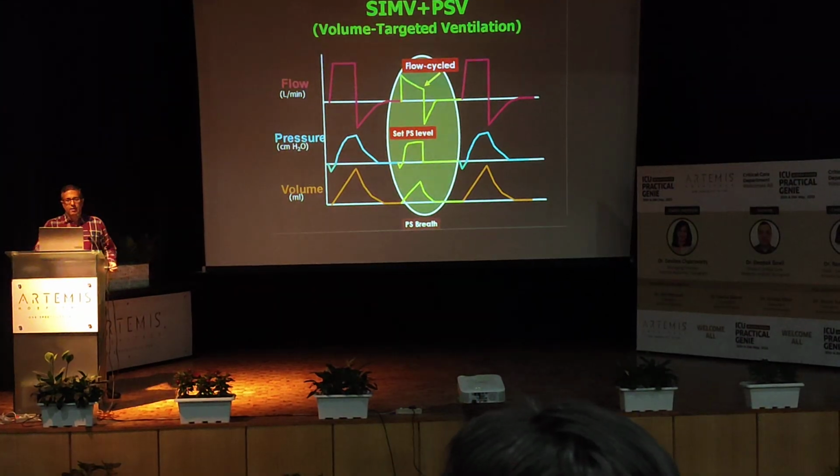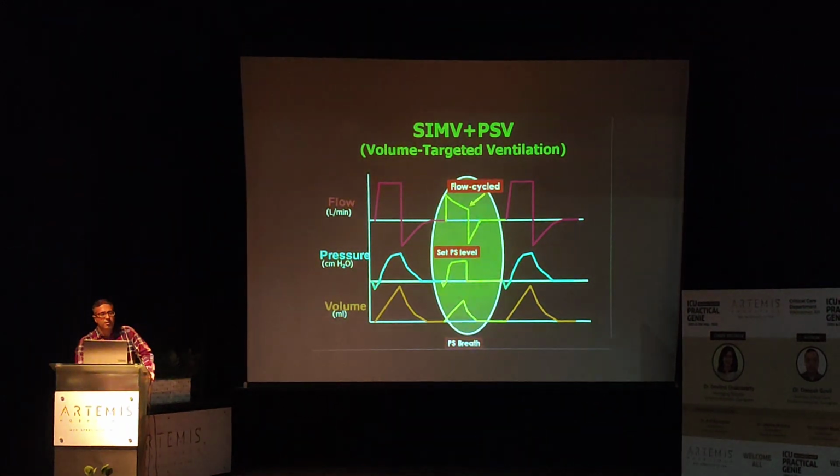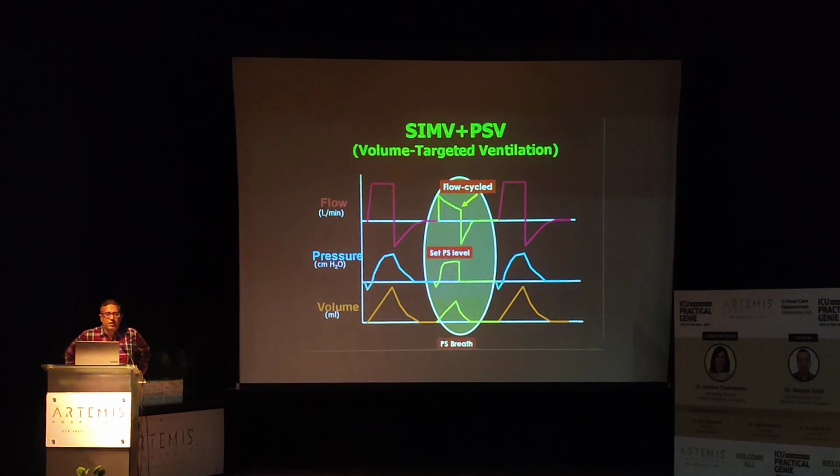So earlier we were using the SIMV modes. What were the SIMV modes? How do you identify them? Volume targeted ventilation and the pressure support ventilation. Yes, sir.